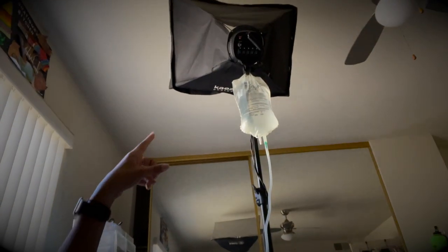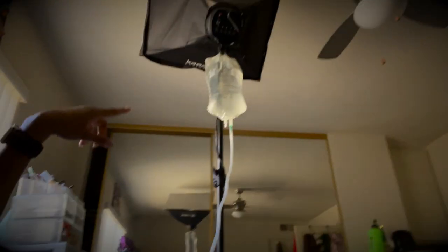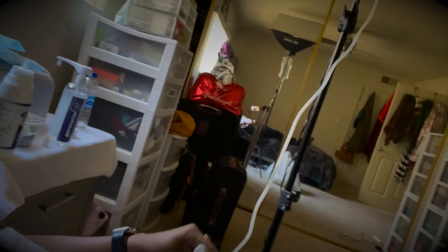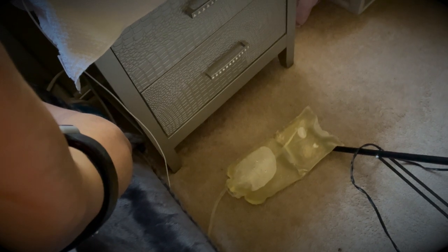I have a stand — it's like a dialysis stand — and I hung my bag up there. It hooks up to me, and then down there you can see the drain bag. It's all connected, and it typically works using gravity.